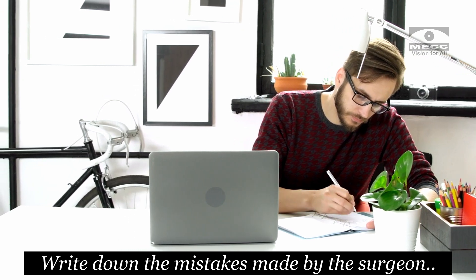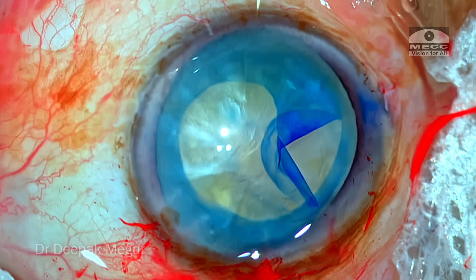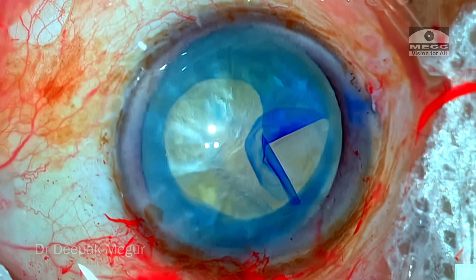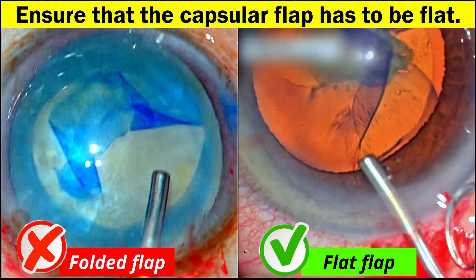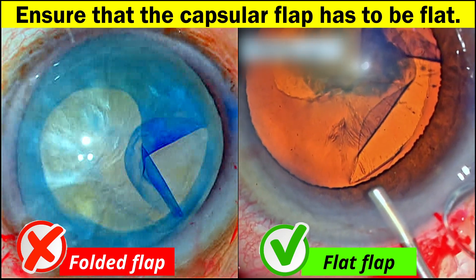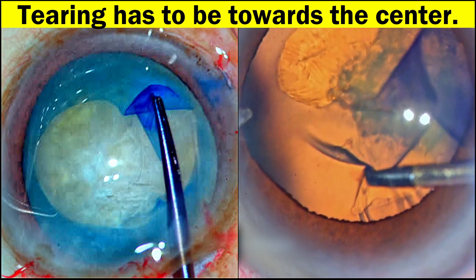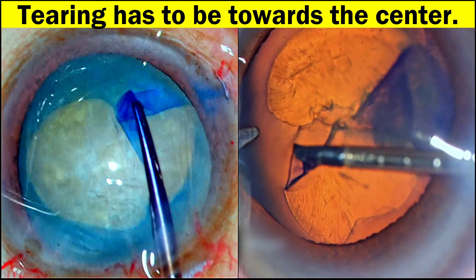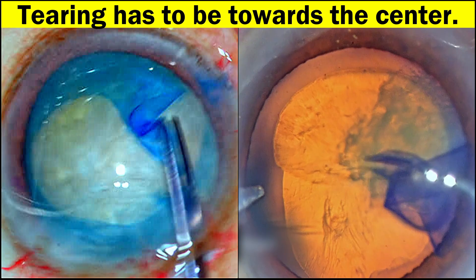Assuming you have noted down the points, let me rewind and show you exactly what happened. Mistake number one: when trying to do the rescue maneuver — the pull-in technique, also known as Dr. Little's maneuver — the capsular flap has to be flat, not folded. With the capsule laid flat, the tearing has to be towards the center of the pupil. You need a brisk and firm pulling action towards the center of the pupil — that is what is going to rein back the rhexis that was heading towards the equator.